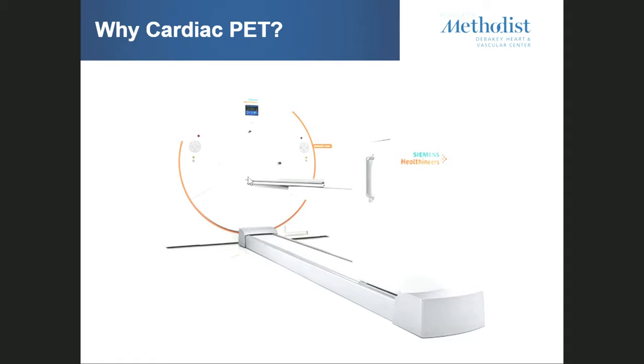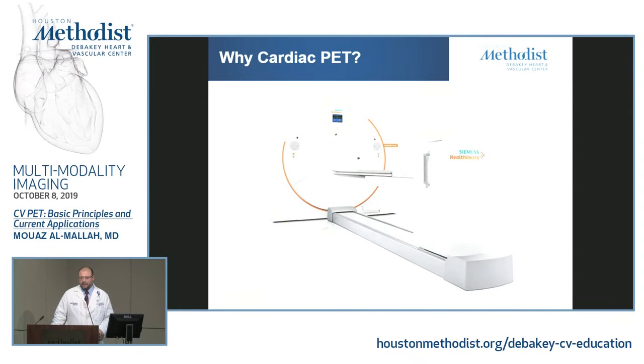This is how a PET CT machine looks, and this is the machine that we have right now in the Research Institute, which we are doing our cases on. It has both a PET machine and a CT machine. Our machine has a 64 slice system, or 128 slice, but covers about 4 centimeters, so similar to 64 slice from others. Usually the CT is in the front, and the back part is the PET. You have these nice covers from different vendors, depending on how they make the PET CT.